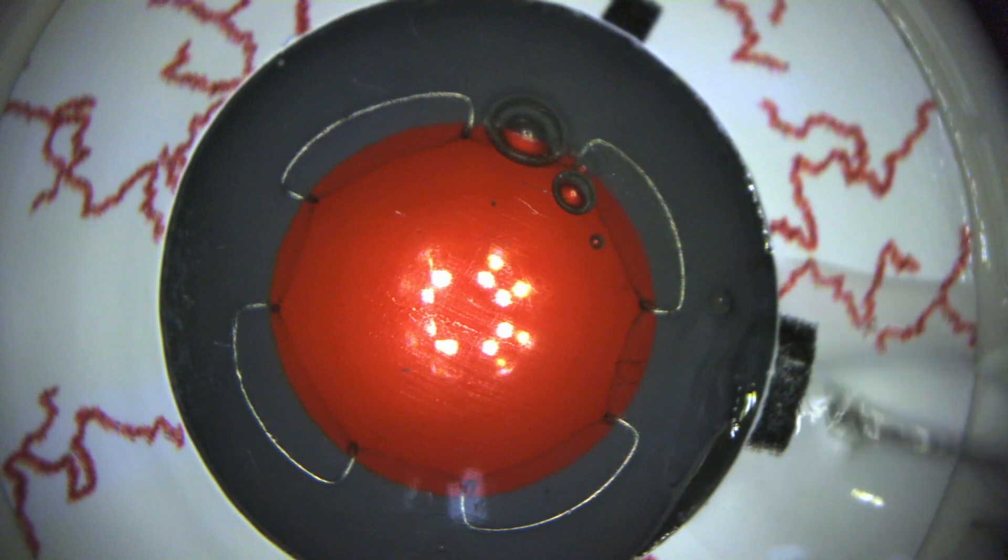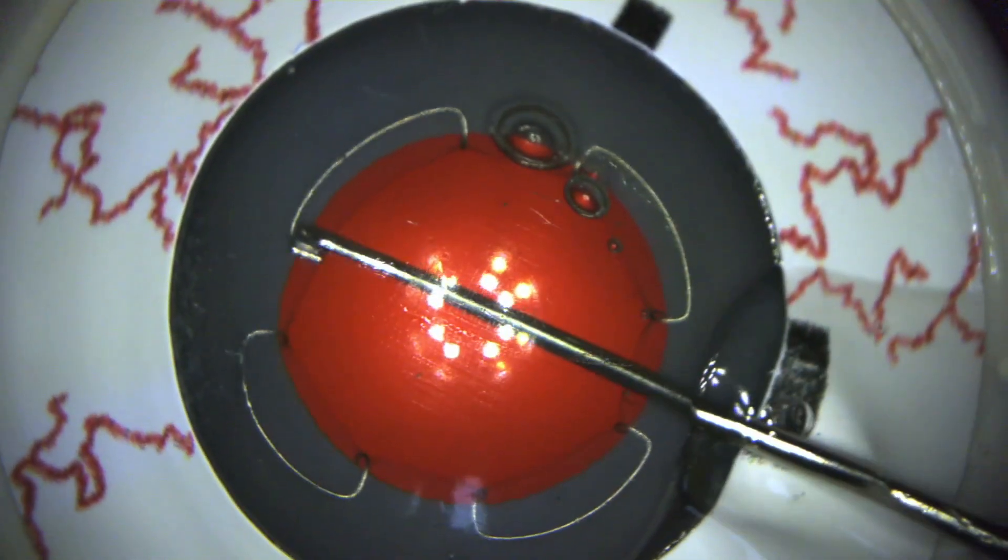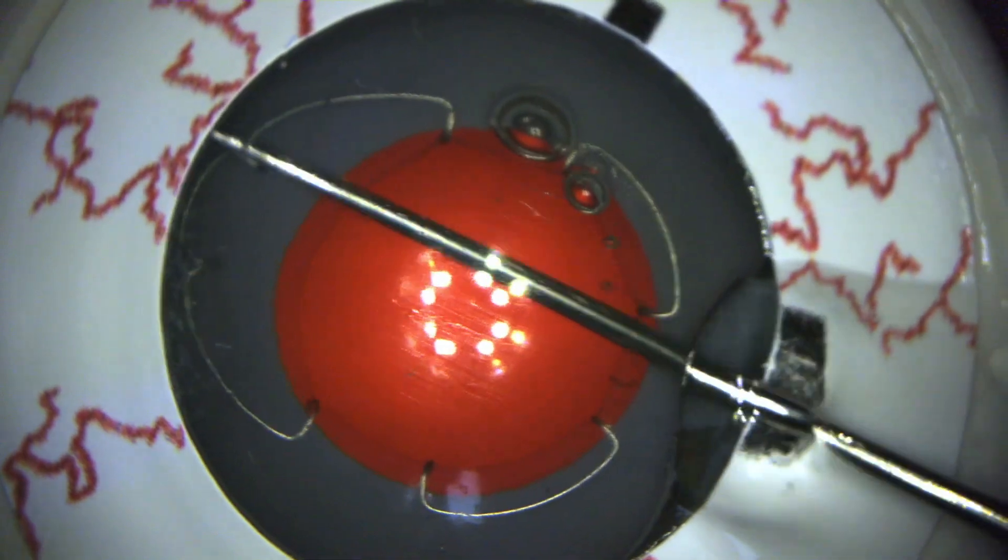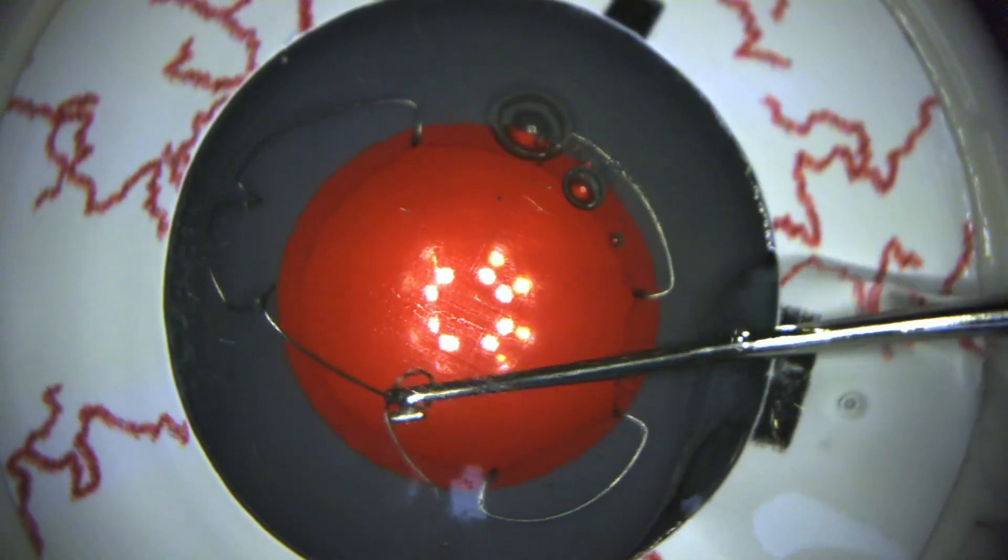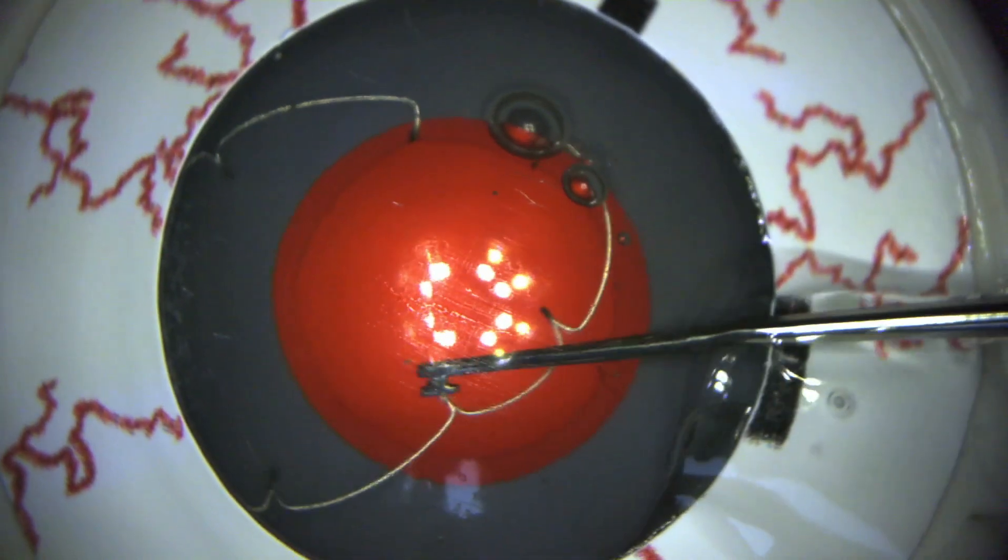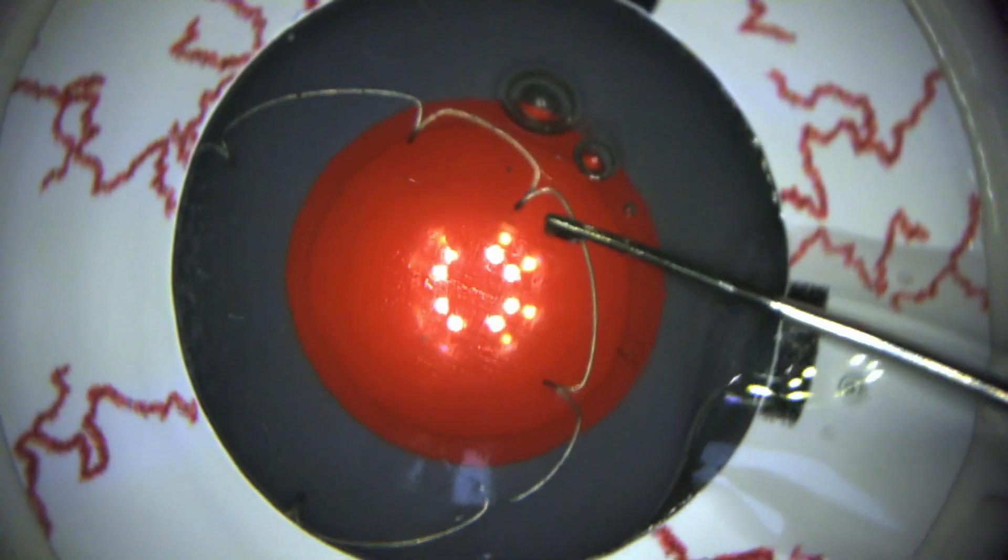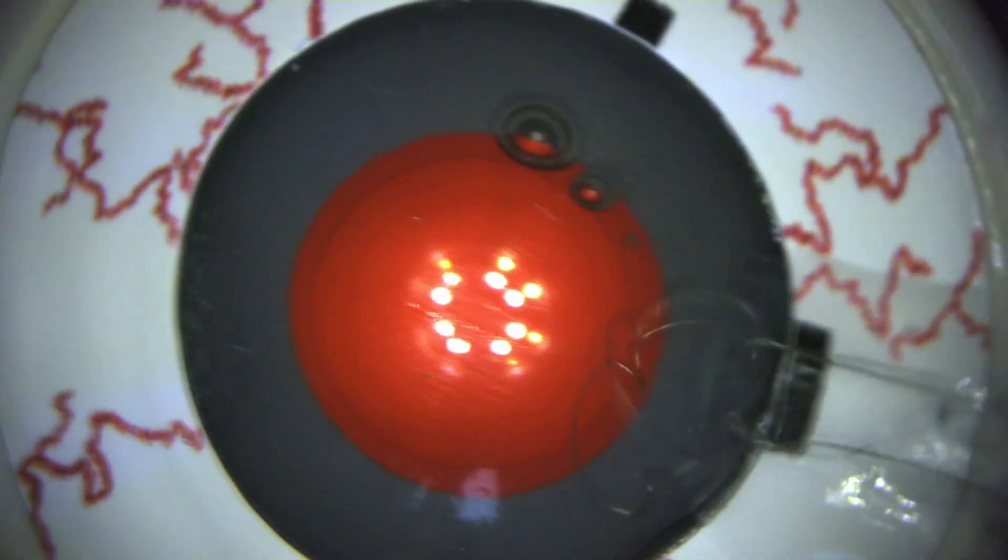When removing the device in its state of iris capsule capture, simply once again disengage the distal foot by grabbing the shoulder, lifting up, and off the iris and capsule. Repeat the same technique with both lateral feet. Disengage the proximal, and your choice is to either guide the device through the incision or with the use of the injector.